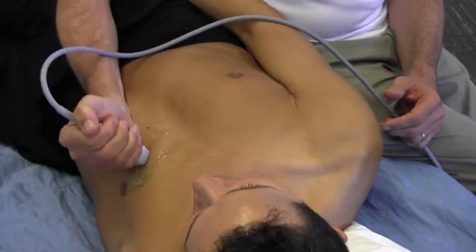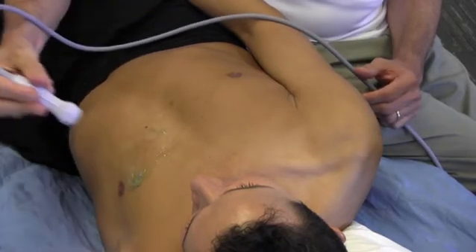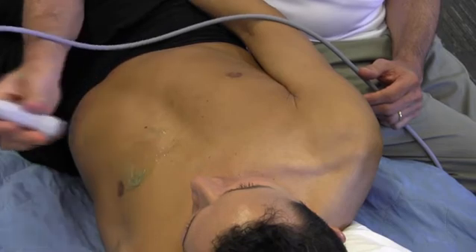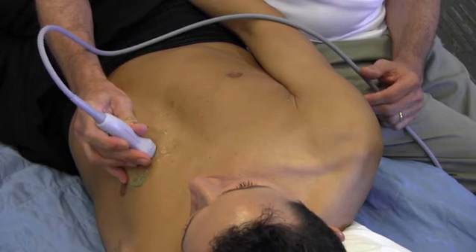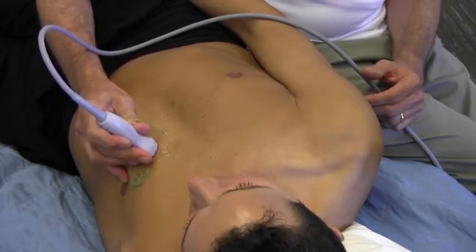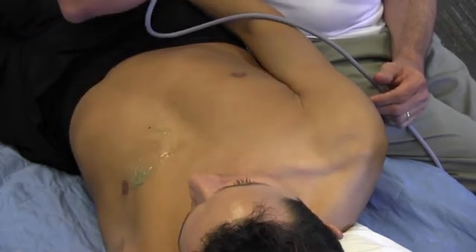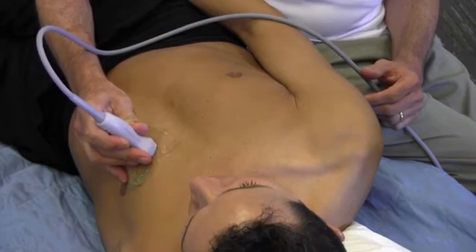The standard pencil hold works for most types of ultrasonography, but in the rest of the course we'll give you some pointers as to some special hand hold positions that are used — for example, for kidney ultrasonography and the subcostal view. Generally speaking, 95% of the time you'll use a pencil hold with the hand on the patient while you're scanning.